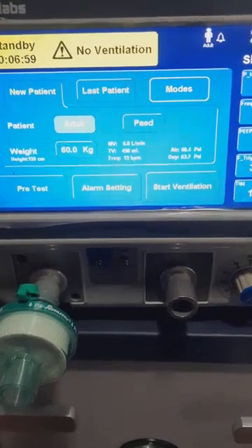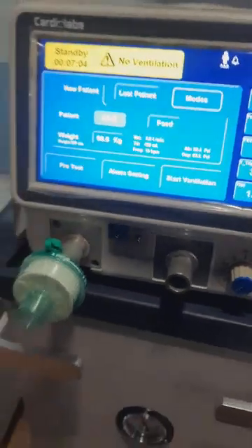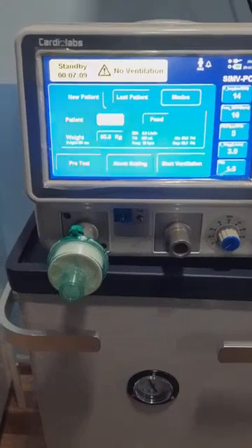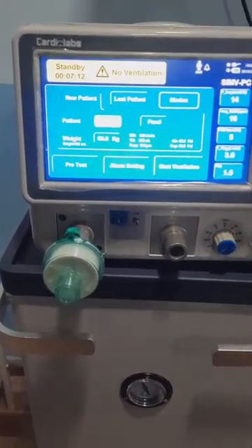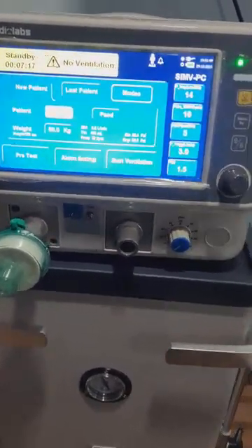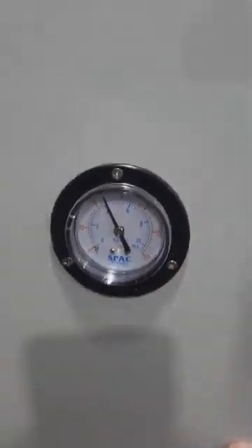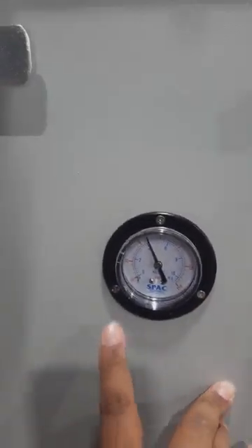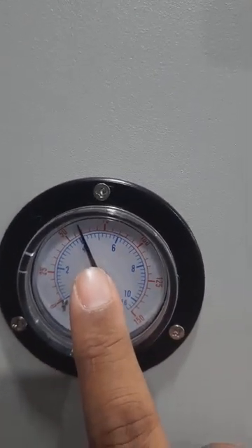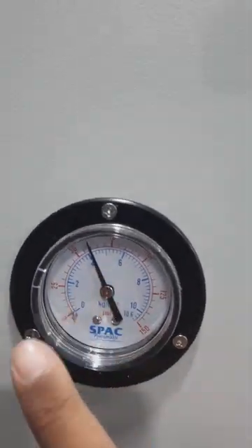Simply giving oxygen to unconscious patients or patients with a diseased respiratory system will not help — we have to give ventilation support and pressure, because the lungs will not expand by supplemental oxygen alone. We need to deliver that oxygen at a certain pressure. Here you can see the pressure gauge which has gone up; it matches the pressure seen on the screen — the screen was showing 61 and the gauge shows approximately 60.